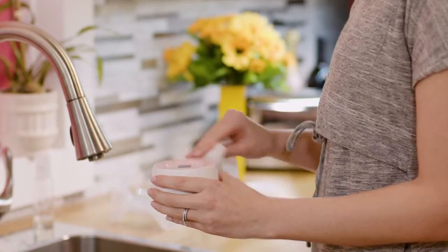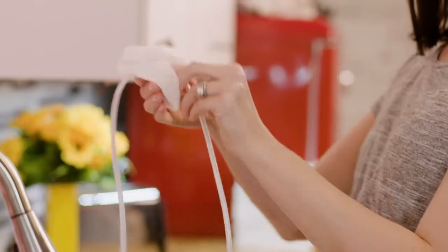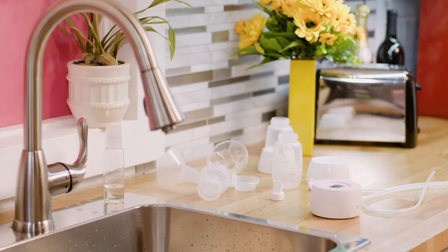Use disinfectant wipes to clean the power switch and countertop. Then clean the diaphragm cap and air tube, also with disinfectant wipes. Let them fully dry out.